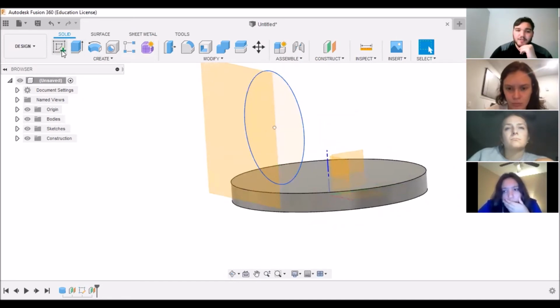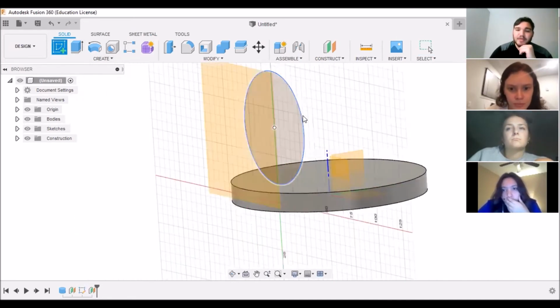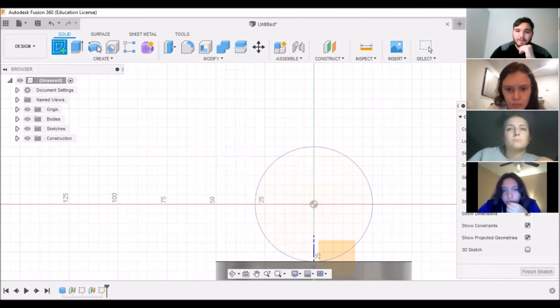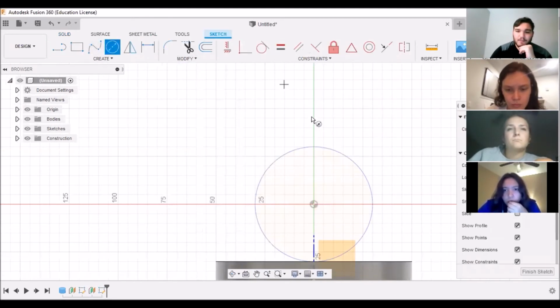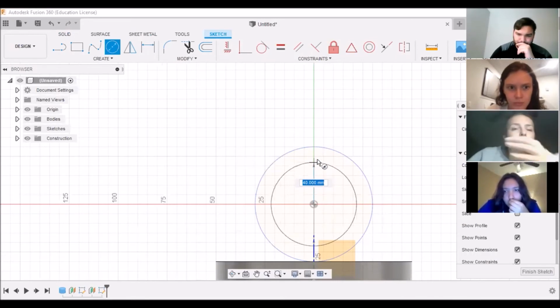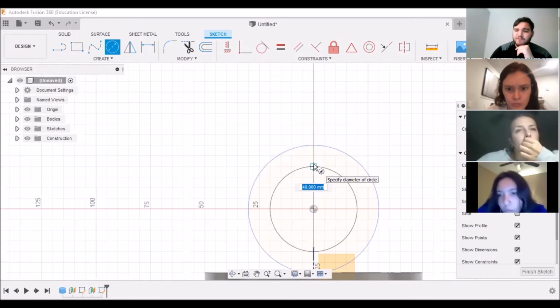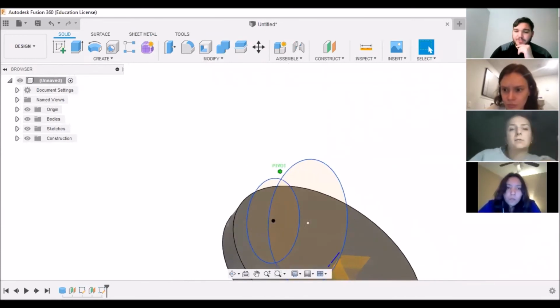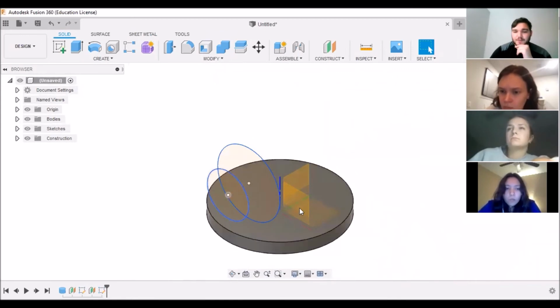From here, we can create another sketch. And since we established our geometry radius from the first circle, we can now sketch on the new plane with a center diameter circle. And it remembers that origin. And so let's, in this case, actually draw it smaller. So instead of 60, we'll try 40. And then finish sketch. And so now we should have 2 smaller sketch circles in parallel with one another.